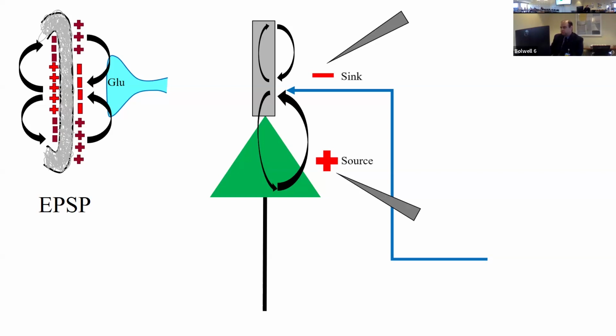So this is the sink, this is the source. Now, this is not a physical thing, actually, it's a mathematical concept. It's just called an electrical dipole created by the differences in polarity in the superficial and deeper layers. So it looks like this. So this is the biological basis of all EEG. EEG is essentially extracellular field potential recordings, which are all biological dipoles.